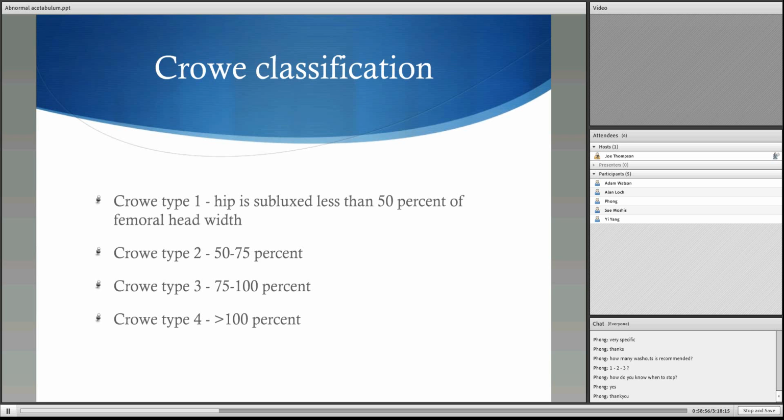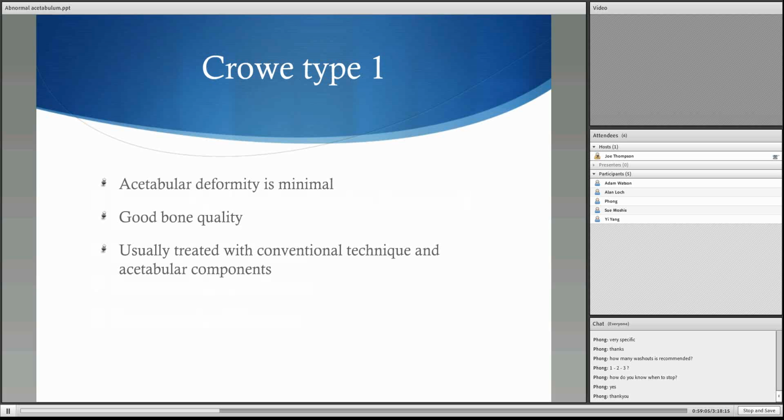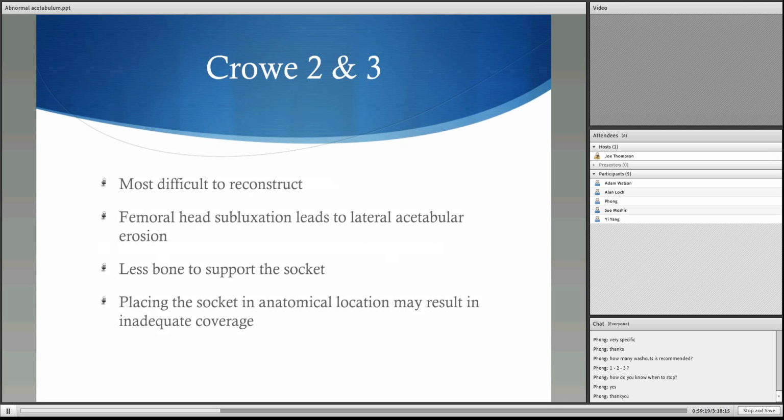Firstly, the height of the pelvis is measured, and in situations where you've got quite significant anatomical abnormality of the femoral head, you'd use a fifth of that height as a guide to the height of the femoral head. The other landmark is the interteardrop line and the medial head-neck junction, and it measures the vertical distance between the head-neck junction and the teardrop.